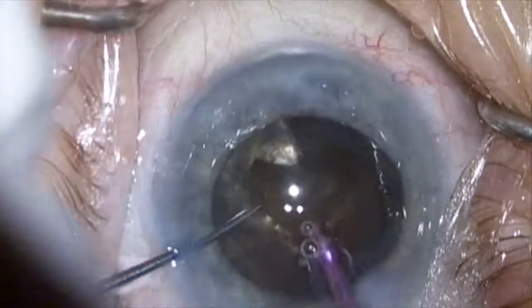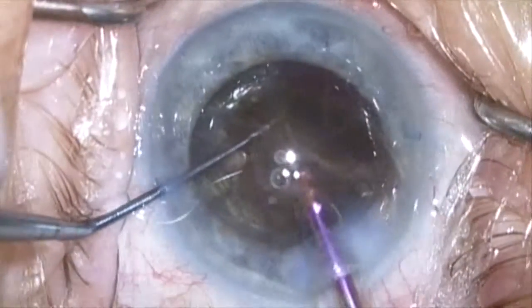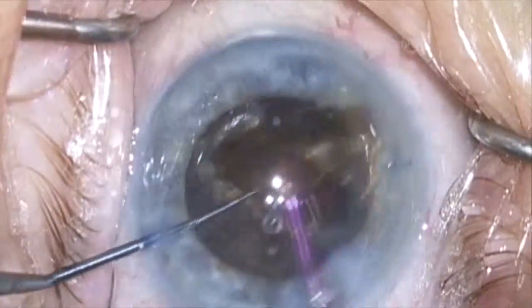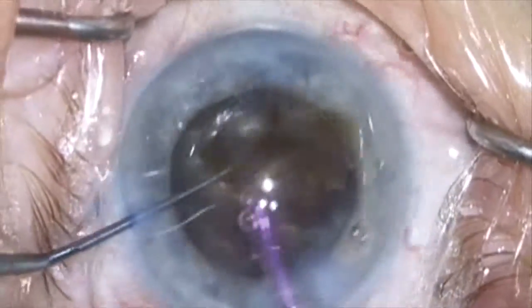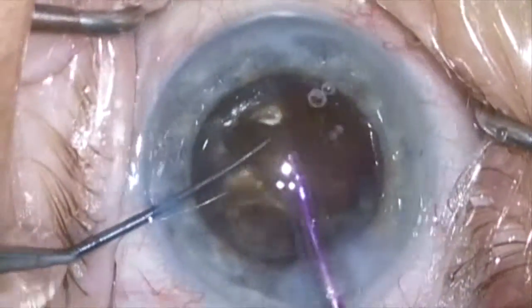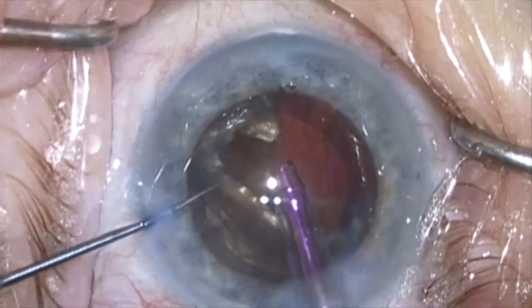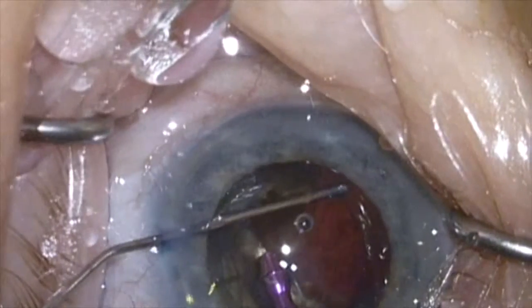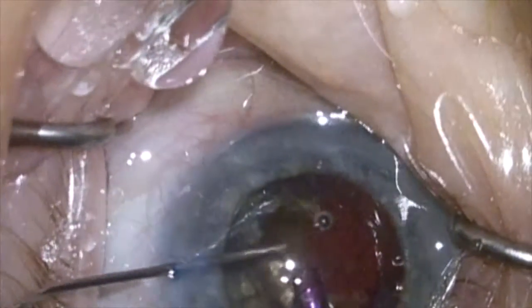There's a real tendency for these pieces to want to adhere to each other posteriorly where the posterior plate is, even though it's been cracked, so you just have to tear these pieces off using this technique. At this point I'm going to stop and add more dispersive viscoelastic to protect the cornea. I'll do this a few times during this procedure.